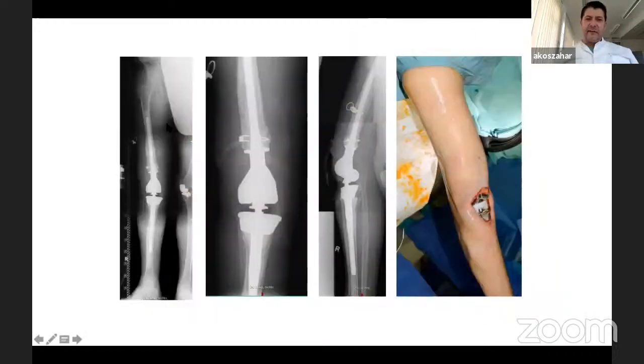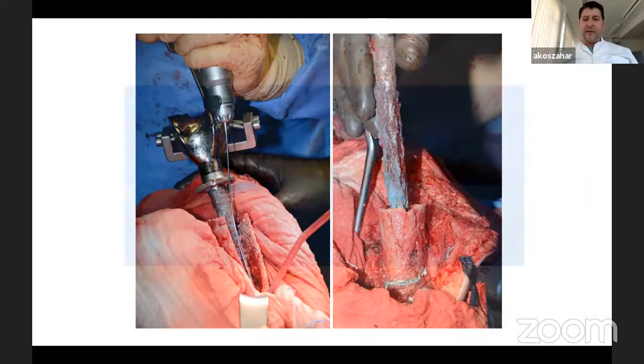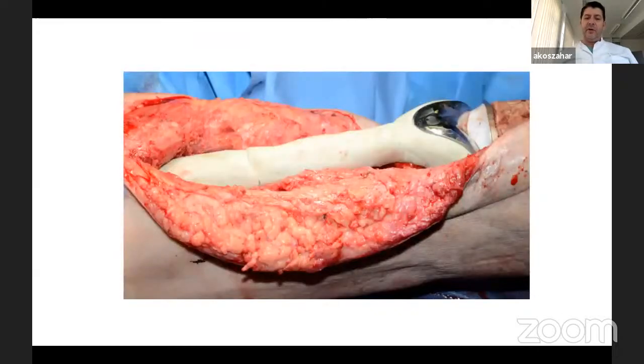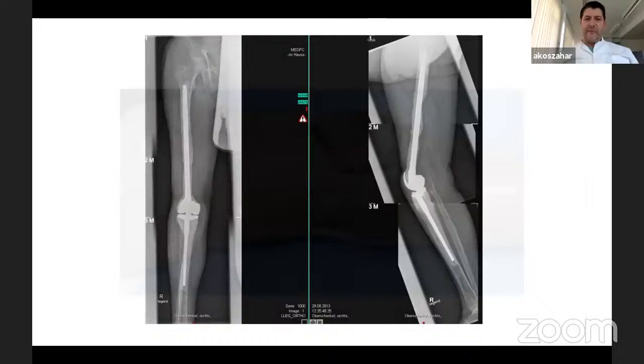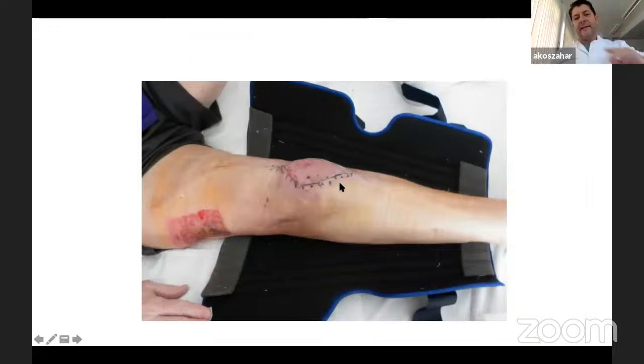So this is the implant. It's very, very hard to remove. As you can see, a lot of cement, long stems, bone loss, bad soft tissue, so this is really crazy to go for one stage. But he wanted to do that, so we removed all the implant, we removed the infection, we debrided it, and then we replaced the knee with a mega implant, coated with antibiotic loaded bone cement, very long stems, with plastic surgery, of course, and with the orthesis, because the extensor mechanism didn't work.